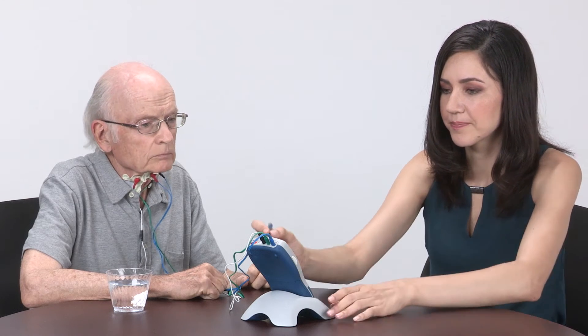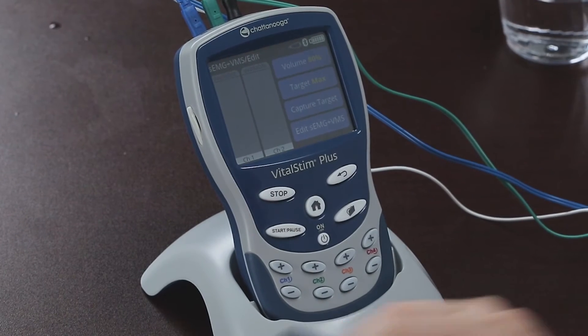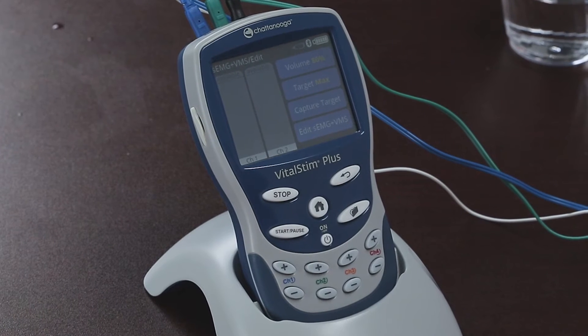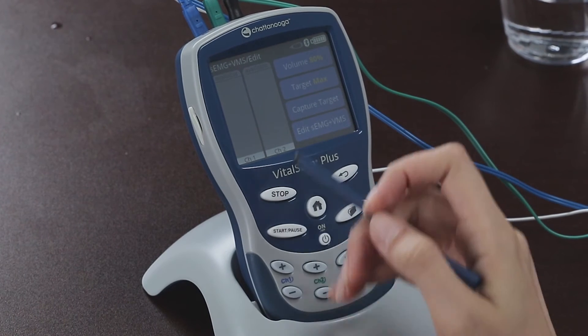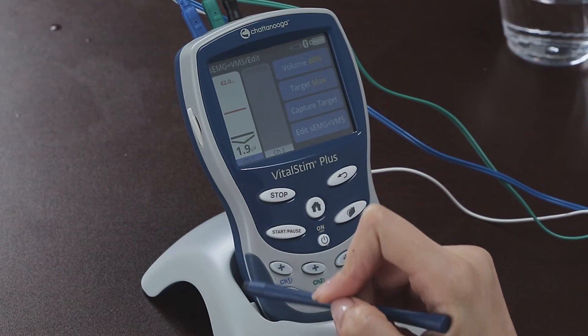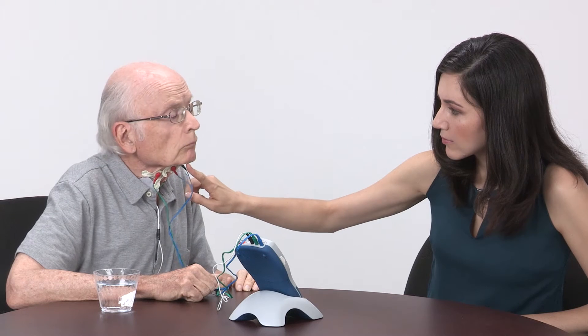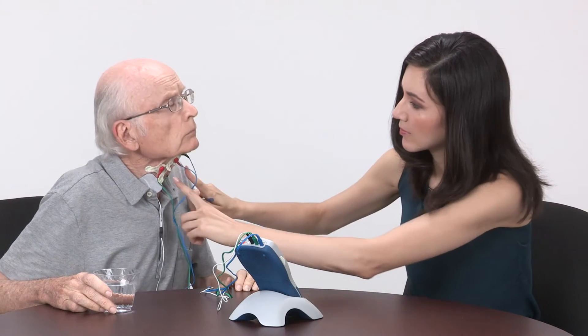Press the gears icon — the settings button — to edit these settings. First, make sure that channel 1 is connected to the triggering muscle group; in this instance it will be the geniohyoid. This is where we want to focus the patient's attention. Channel 2 will be delivered to the thyrohyoid muscles — this is where the stimulation will be delivered.